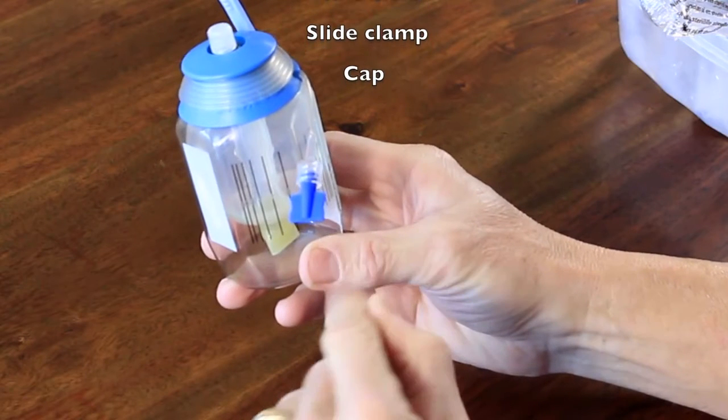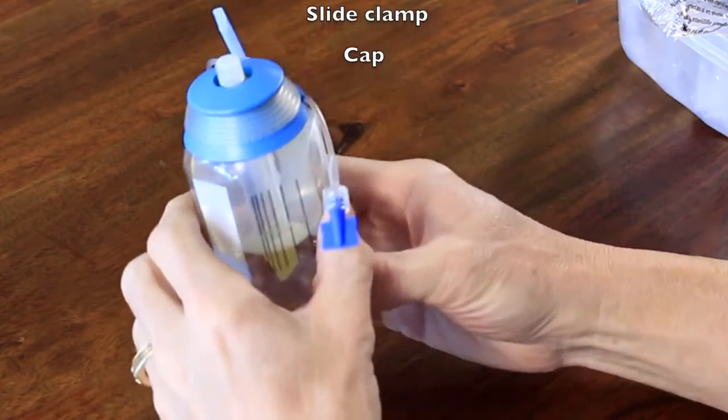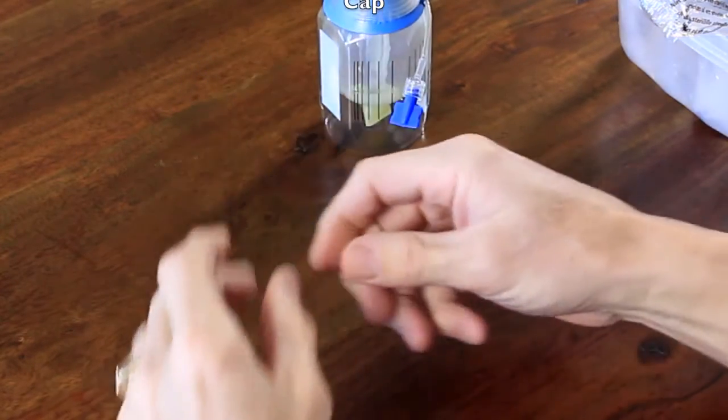If you said no to any of these when you were looking at your bottle, you would not use it. You need to pull another one from the fridge, but you'd have to call your nurse so that they can order an earlier delivery because you'll be short one Intermate. You can set the bottle aside.